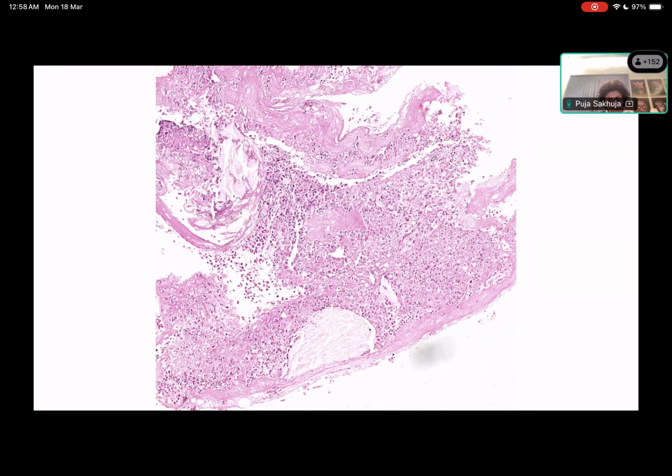You say it's eosinophilic esophagitis, then you put in a note some comments for the clinician. So what are the clinical conditions in which eosinophils can be raised? In any of those we cannot call it eosinophilic esophagitis. Any secondary causes or any history of allergy, asthma. Allergy, asthma are very commonly seen in eosinophilic esophagitis also. And hypereosinophilic syndrome. Okay. Peripheral smear also.